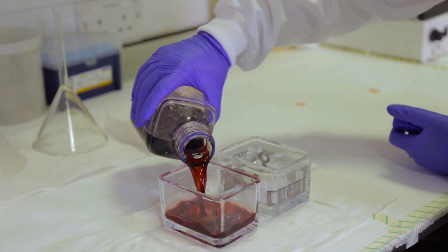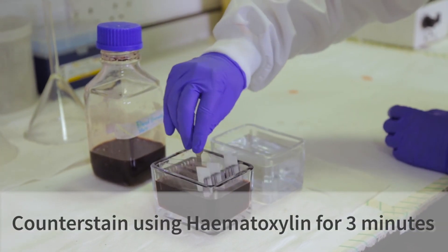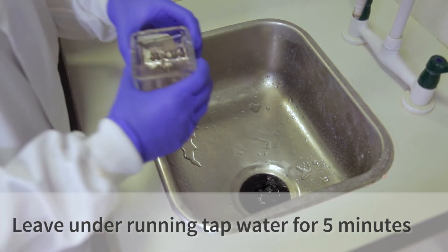For the counter stain, we use haematoxylin. The slides are stained in haematoxylin for three minutes. Next, they are placed in water. They are then kept under running tap water for five minutes.